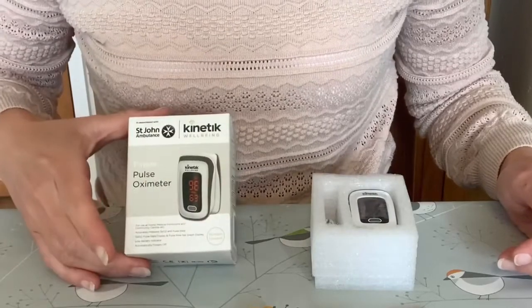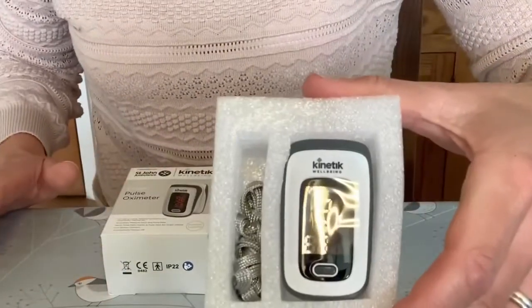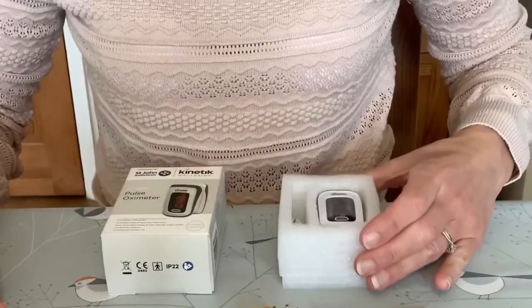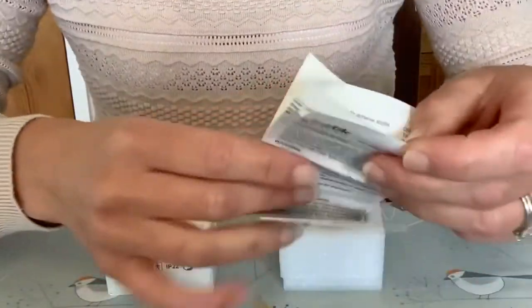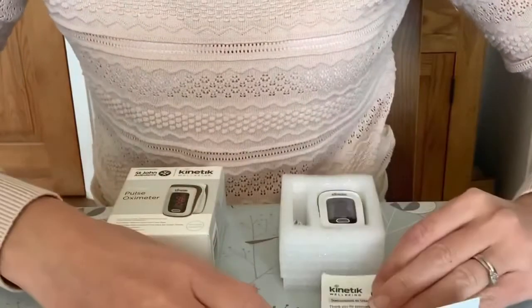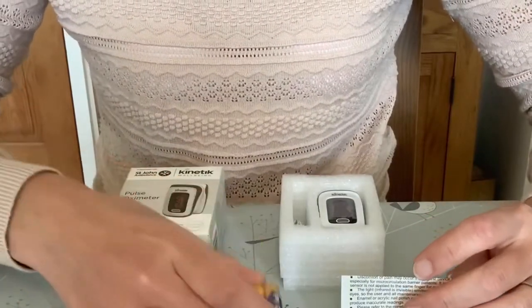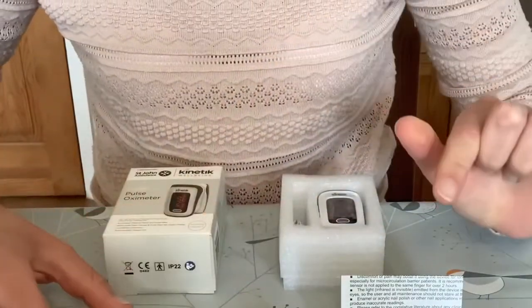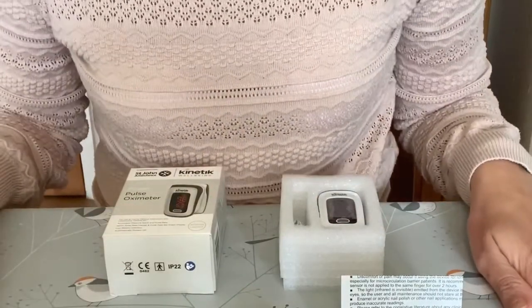Inside the finger pulse oximeter box you'll find the device itself, which is very small and portable. It comes with a lanyard for it to be worn around your neck. You've also got the instruction manual, two AAA batteries to go into the device, and some information on St John Ambulance. Every purchase of this device goes towards their life-saving work.